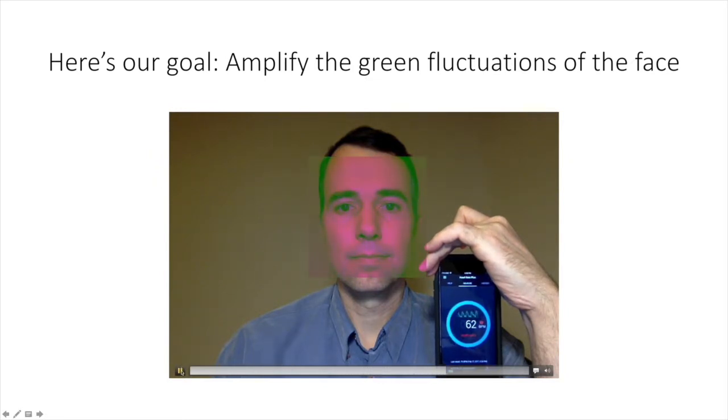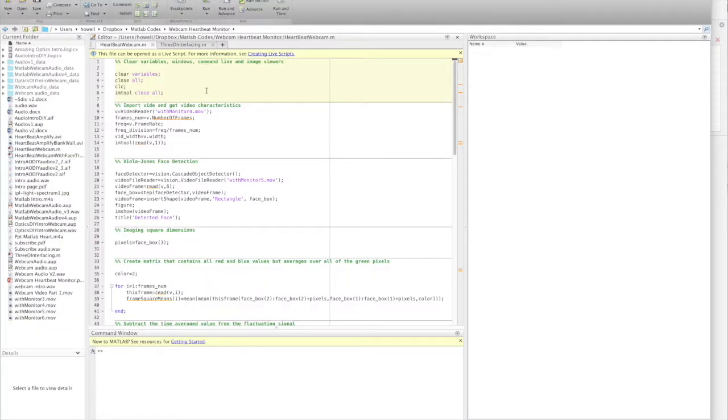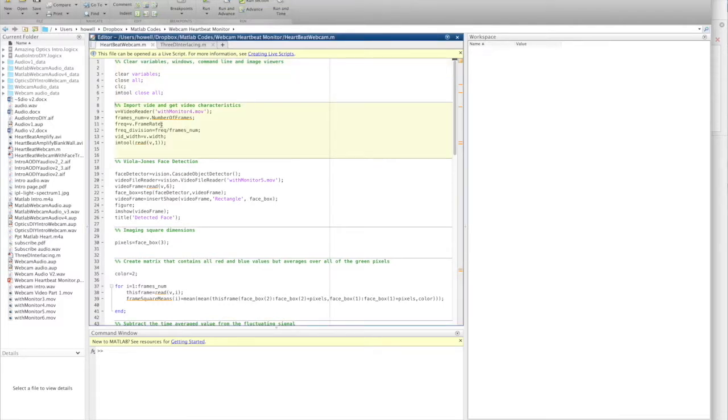So let's go through the MATLAB code for a heartbeat monitor. In this first section, we just run some initialization commands. Let's run this section in advance. We now read in a video I made using Apple's Photo Booth. We get the number of frames, frame rate, and width for use later in the program. We also define freq_divisions, which is used to convert Fourier transform coordinates to frequency units.